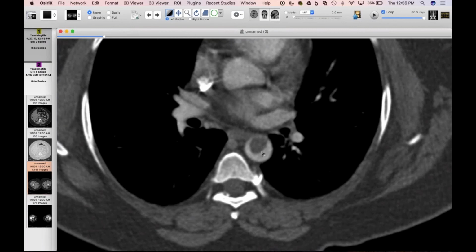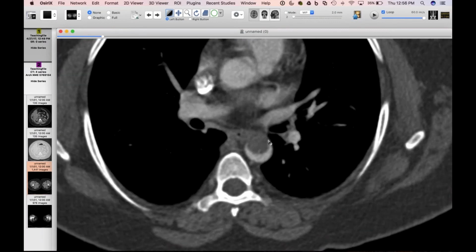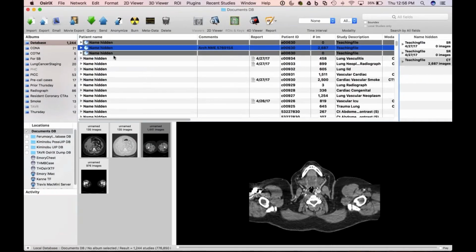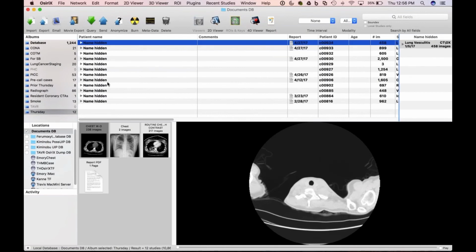And no one knows what to do with them either, because some of them may be treated with surgery or with stent coverage or with anticoagulation, and some of them resolve and some of them don't. So maybe chronic thrombus develops here too. I don't know if anyone else has any answers, or if somebody wants to put together a big case series. That's probably the last one I'll show for now. I don't know if anybody else has any.